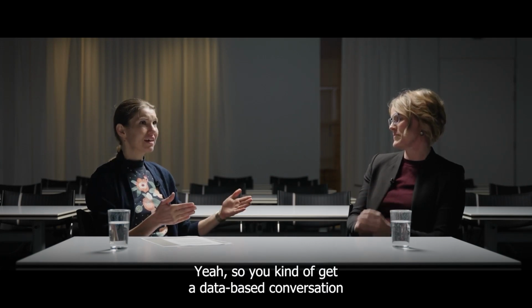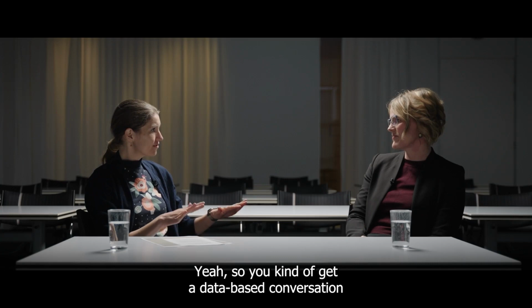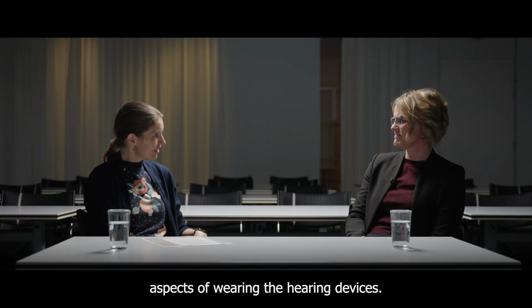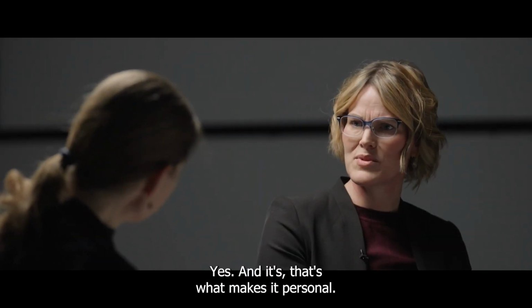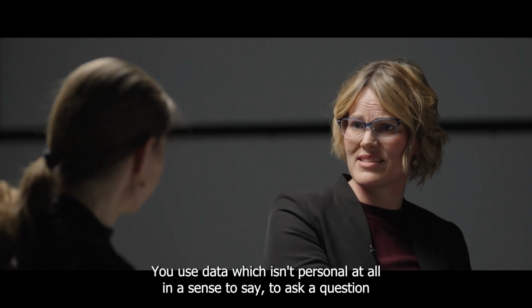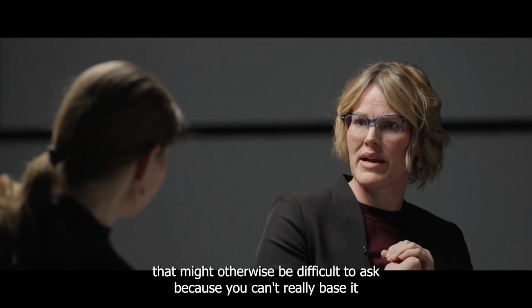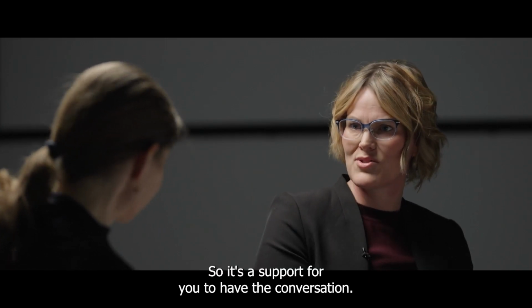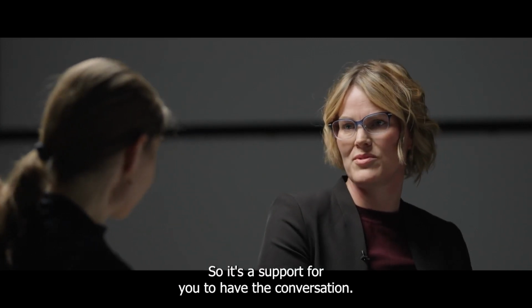Yeah, so you kind of get a data-based conversation where you can get to talk about these social engagement aspects of wearing the hearing devices. Yes, and that's what makes it personal. You use data, which isn't personal at all, in a sense to ask a question that might otherwise be difficult to ask because you can't really base it on anything. So it's a support for you to have the conversation.